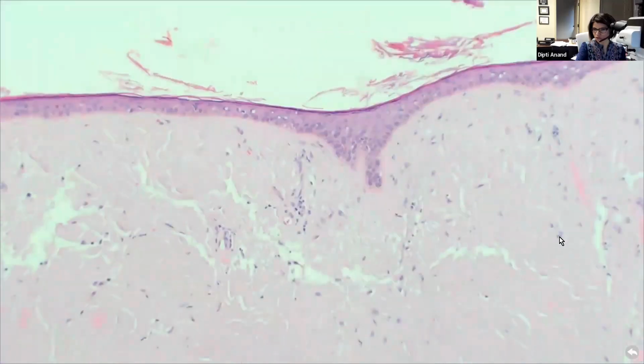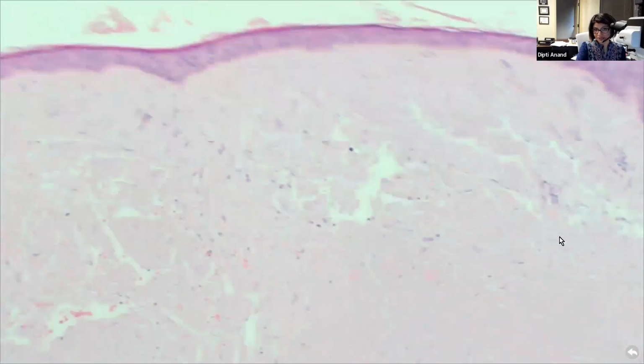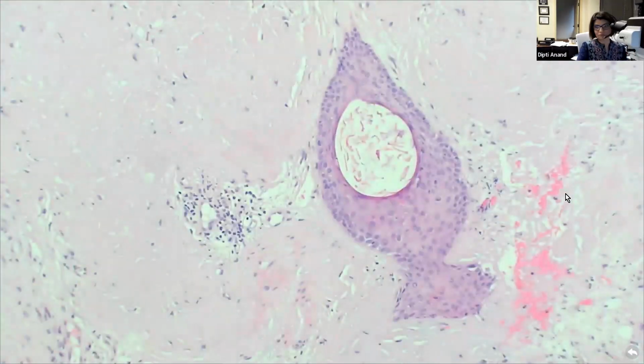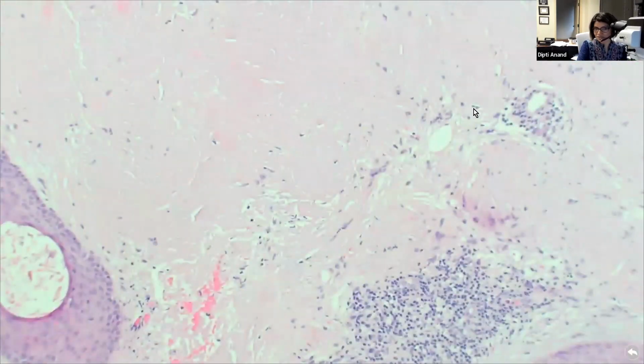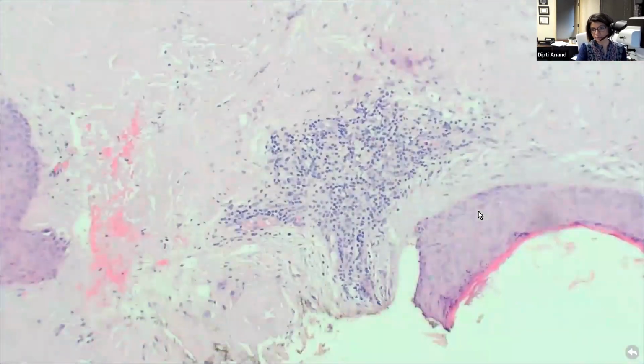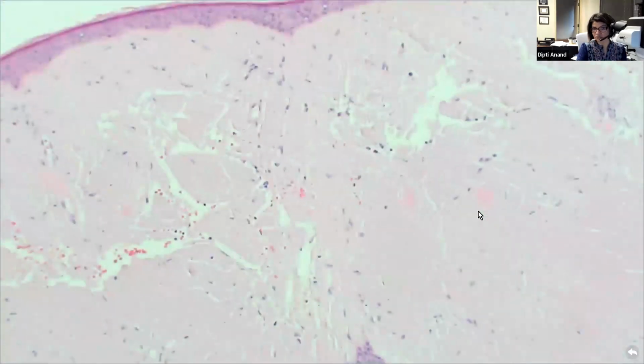So sometimes this hemorrhage can be a clue. The second thing is that it's not immunogenic, so it doesn't incite much inflammatory response. So you wouldn't see any granulomatous inflammation or anything with it. So you can see this nice amorphous eosinophilic material, which is deposited around the hair follicles, around the vessels. It's around the vessels where it more commonly begins. So if it is not that obvious, if you're not seeing it as a sheet-like pattern, then you look for the vessels and you look for deposition of this substance around the vessels.